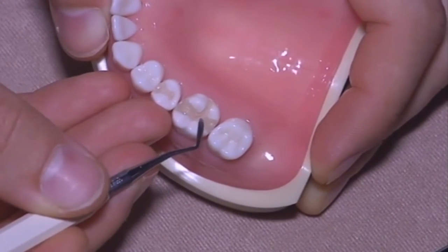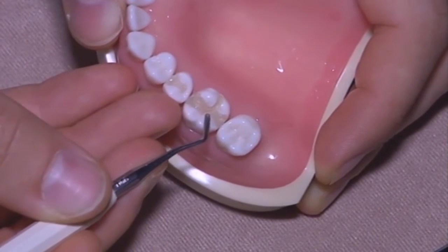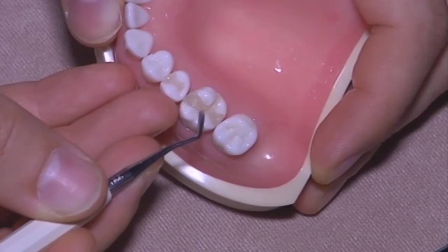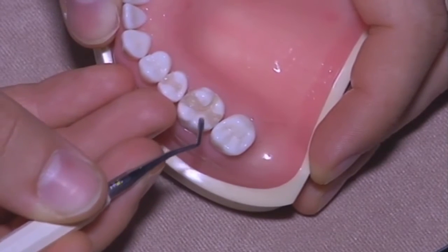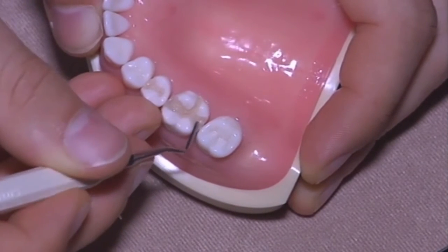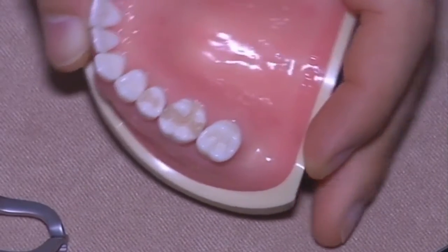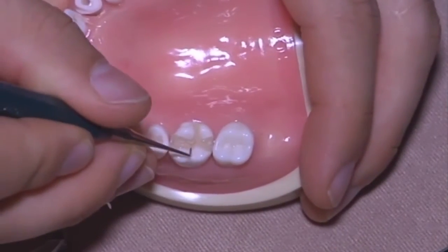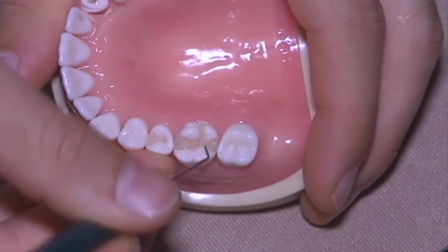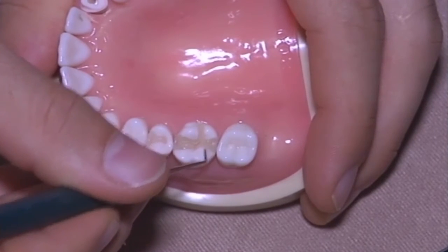It's gonna take you 5 minutes more working cusp by cusp now, but it's all time which is saved in the occlusal check, because you can work better in giving the right shape, which is automatically an advantage in occlusal contacts.